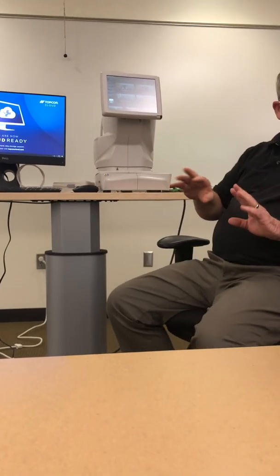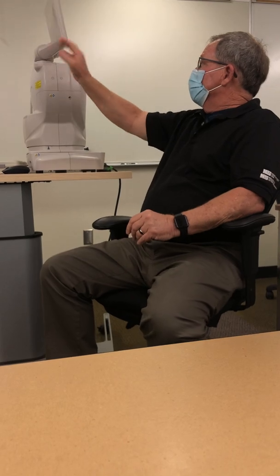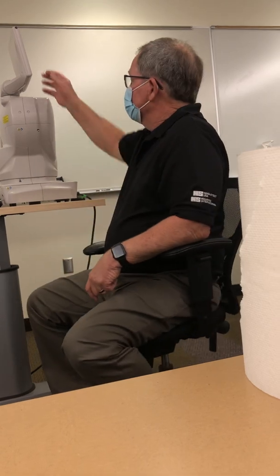Sometimes a patient's a little bit difficult to manage. They keep moving their forehead away from the forehead rest. You can flip this up like that and go on the other side. So you can actually be right there with the patient. You can hold their head if you have to. You can also turn it over to this side. So you could technically have this sitting in a corner of a room, like over there. It takes up hardly any space. It's really nice.